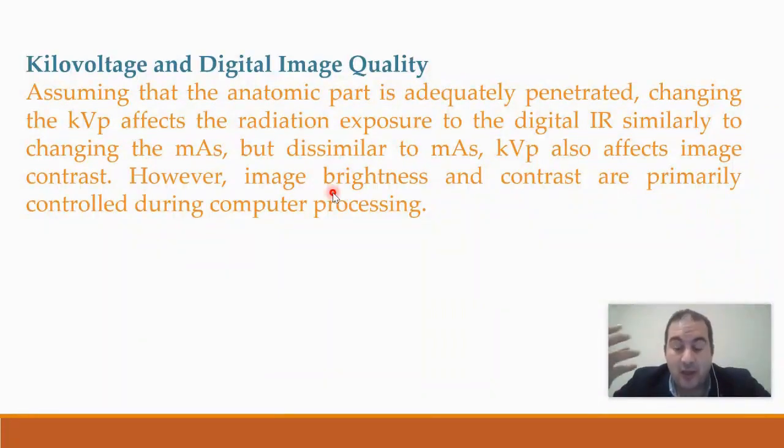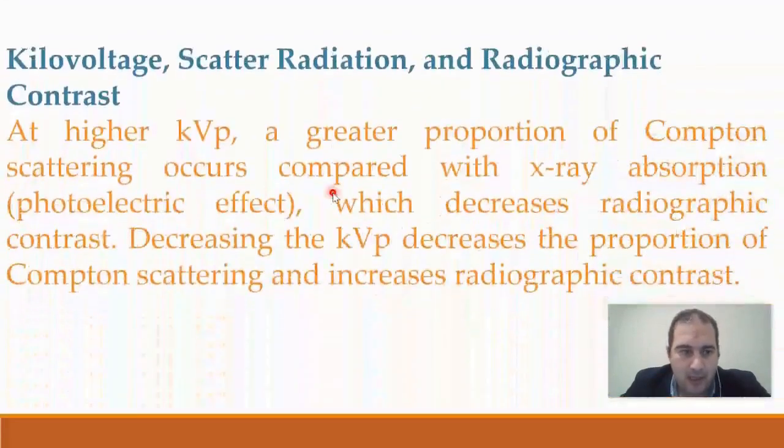However, in digital radiography, as I mentioned, it has a higher quantum efficiency. Thus, its sensitivity to radiation is high. The idea here is that you have the option of post-processing. So if you reduce the kilovolts and the milliampere, it will also affect the contrast. But as I mentioned, you have the ability to manipulate and improve it later, even with high kilovolts.